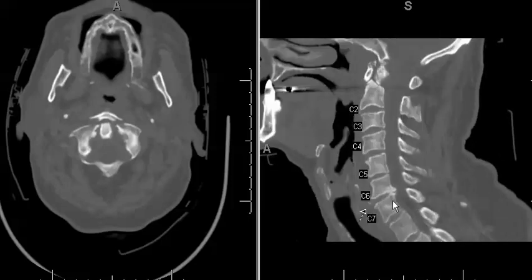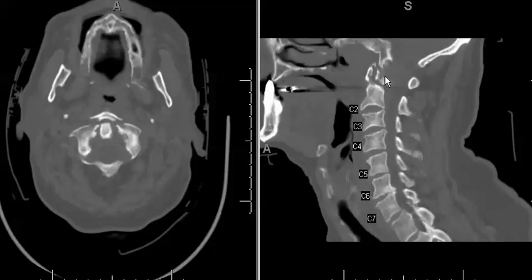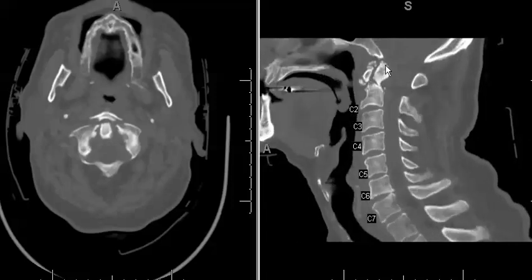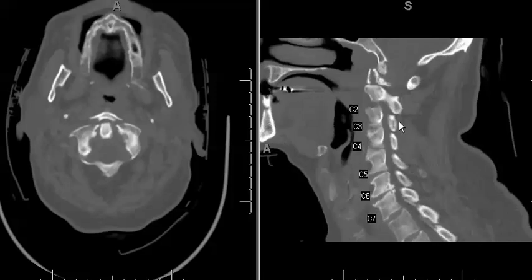With all these findings combined, this patient should have received an MRI examination of the cervical spine to assess for ligamentous injury. The anterior longitudinal ligament was certainly compromised in this case, and it would be important to assess the posterior longitudinal ligament, the transverse ligament, and the alar ligament given the degree of fractures seen here.